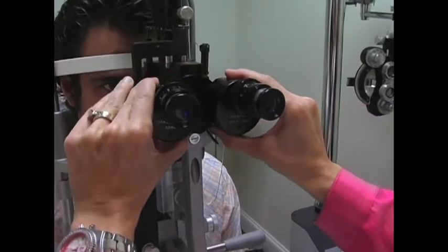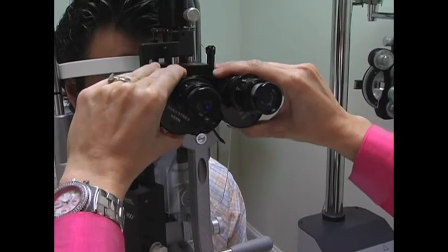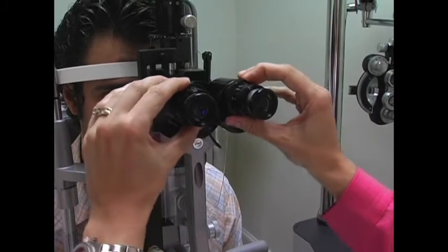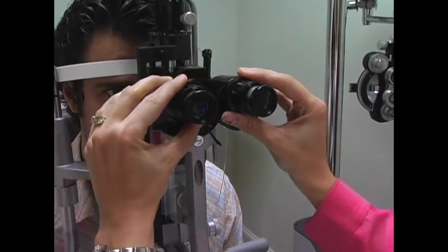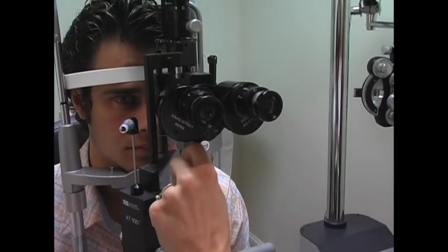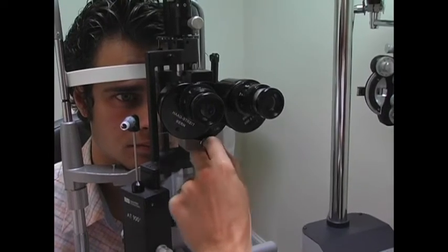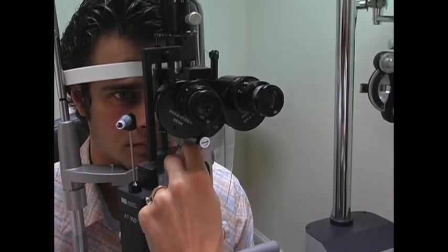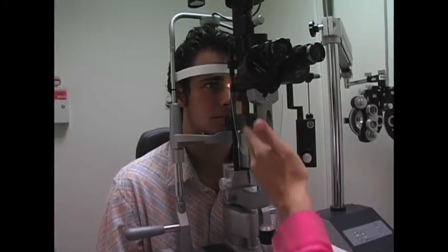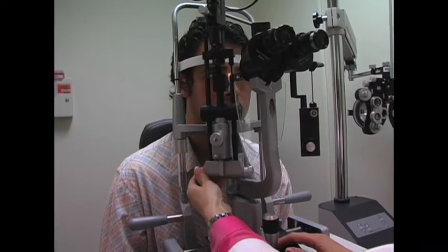The examiner needs to adjust the eyepieces of the microscope to accommodate their own interpupillary distance, or PD, before beginning their exam. In general, the fine focus dials on the ocular should be set at zero. Magnification can be changed from 10x to 16x by moving the lever between the eyepieces. You should start your exam at the 10x magnification level and increase to 16x to better visualize subtle findings. For most examinations, you will want to keep the microscope arm in the midline position and rotate the light source to maximally illuminate the eye.